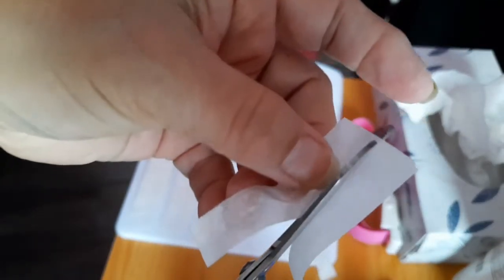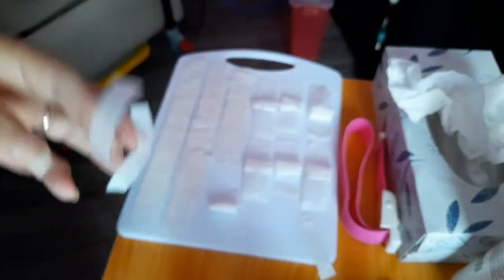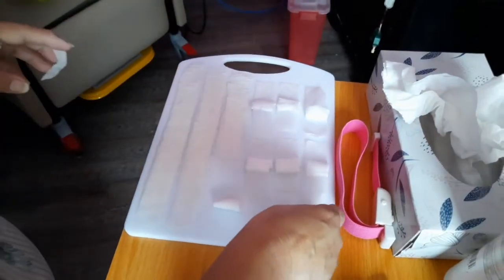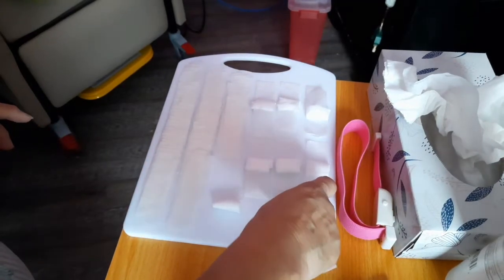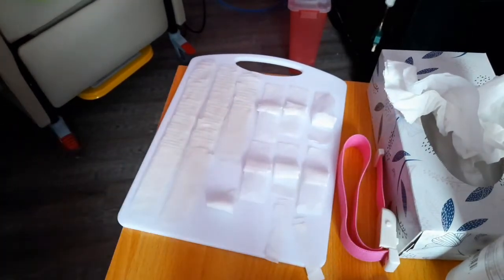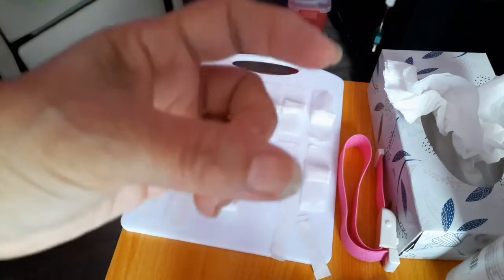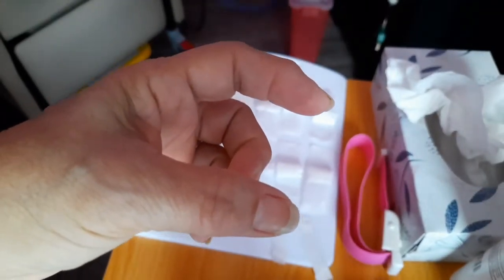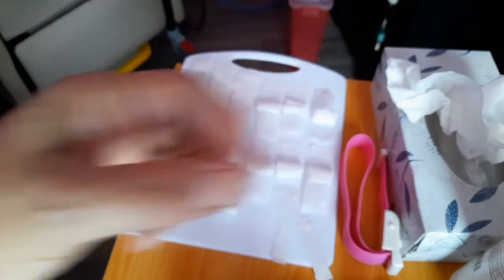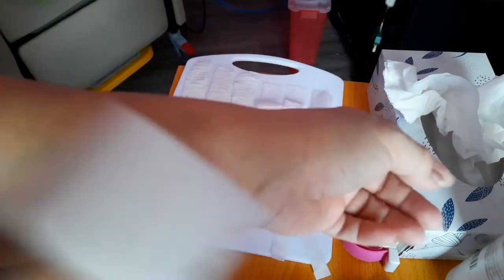And I make them long because I have little fingers. Of course, I have a small hand. I'm a woman, whatever. Hester has bigger hands than I do, and so I make them long because it's hard for him to manage little strips. Okay, so I got my wings. 4. Because there are wings on either side of the needle, so you need 2 for each needle. So there's 4 there.